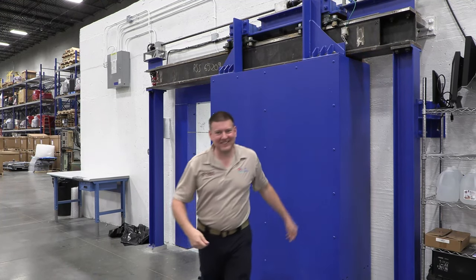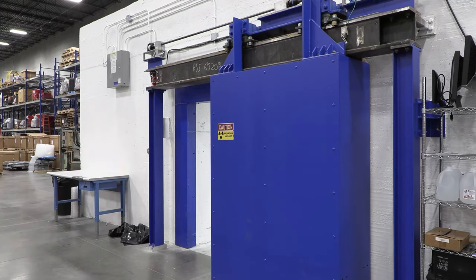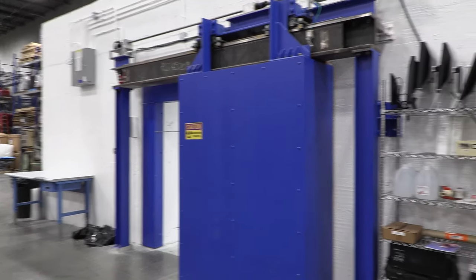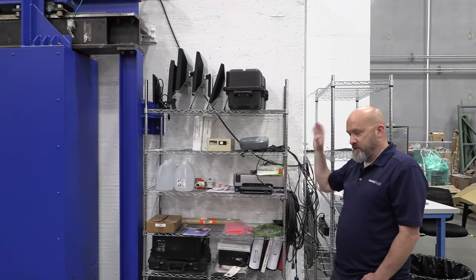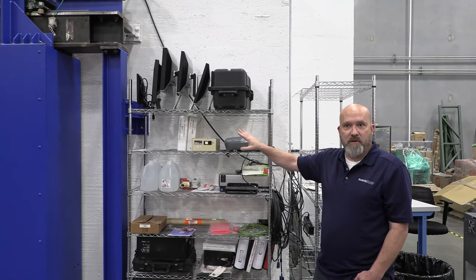Look how thick this door is. It has to be a neutron door. It has to be that thick because once the high energy photons start bouncing around, it can make neutrons. Right. And we got to make sure a door can handle keeping the neutrons in the bunker.